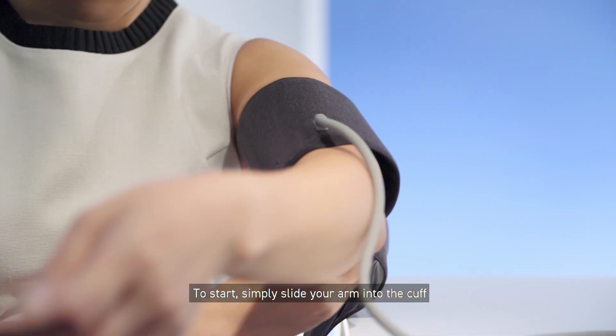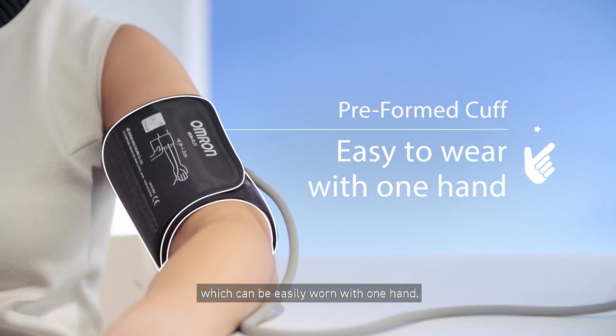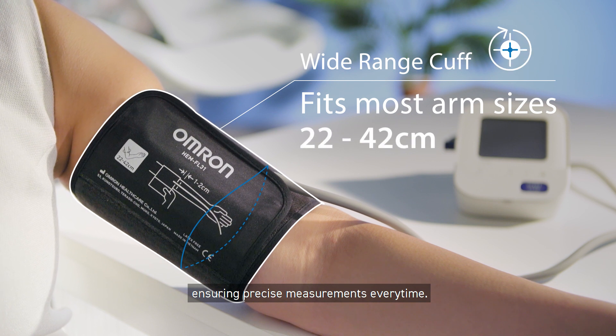To start, simply slide your arm into the cuff, which can be easily worn with one hand. The wide-range cuff is designed to suit most Asian arm sizes, ensuring precise measurements every time.